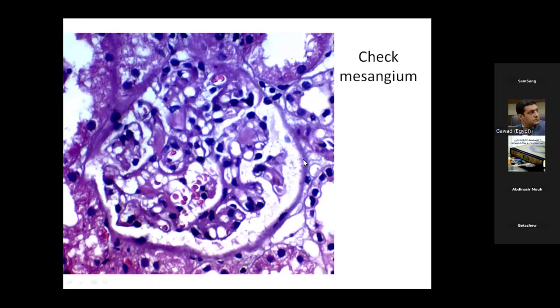Let's check the mesangium here. Can anyone tell me about the mesangium? Can anyone describe it? No answers? Nothing is written in the chat box.